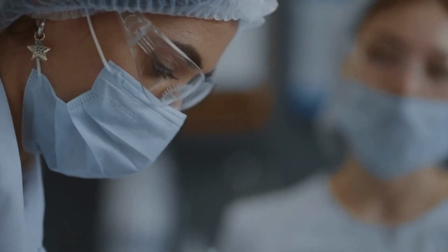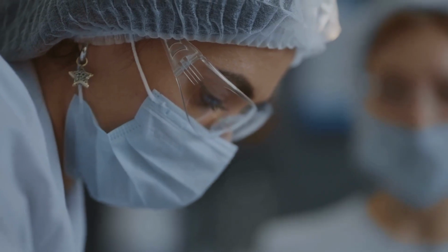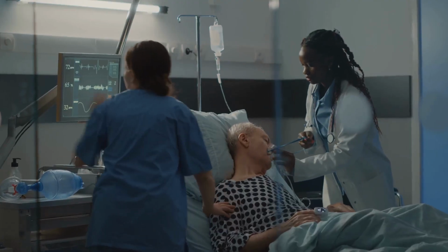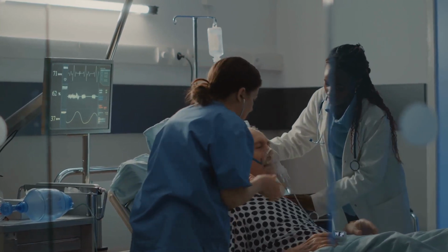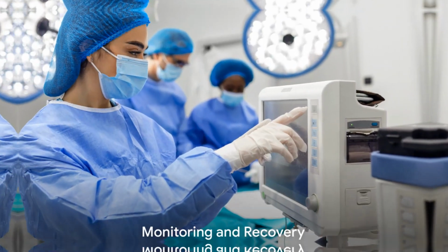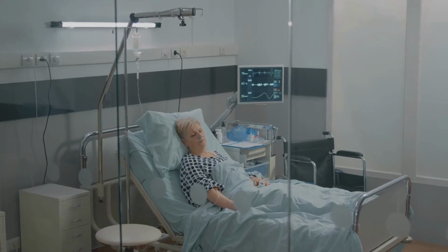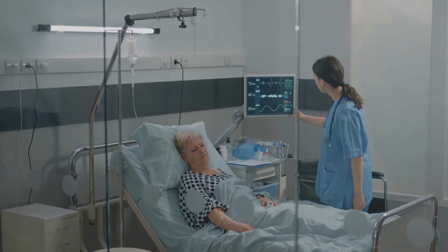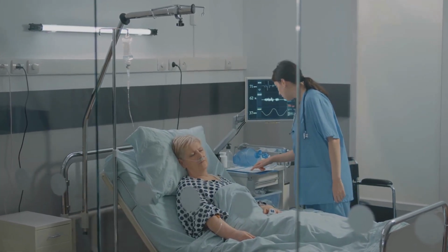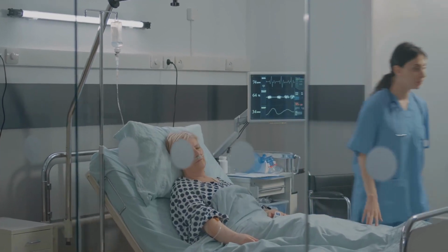Next, the anesthesiologist removes the endotracheal tube gently, taking care not to stimulate the vocal cords. Remember, the goal is to maintain a deep level of anesthesia to avoid any coughing or bucking. Once the tube is out, the anesthesiologist must closely monitor the patient's recovery from anesthesia. This includes checking vital signs, ensuring adequate oxygenation, and watching for any signs of airway obstruction or aspiration.